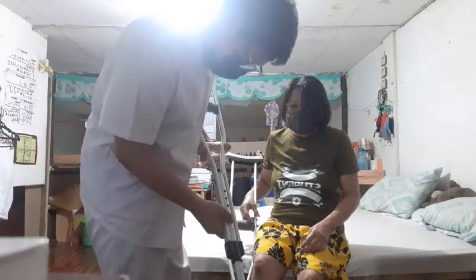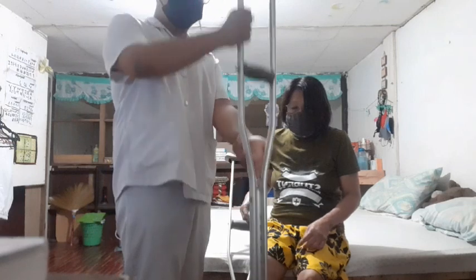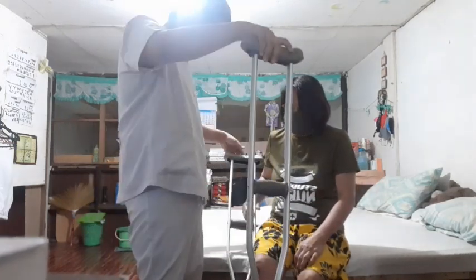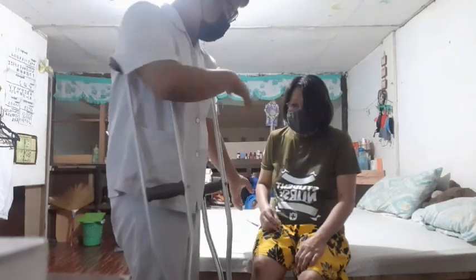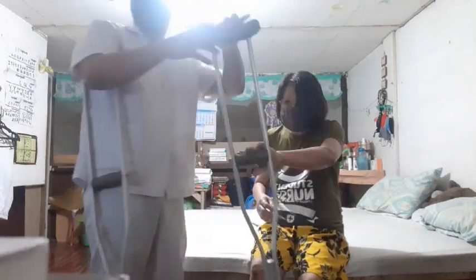Make sure the shoes are non-skid, hard-soled, and low-heeled. Assist the client with comfortable clothes. Measure the client for correct crutch fit. Make sure also to lower the height of the bed and lock the wheels, and then slowly help the client into a sitting position, and assist for any dizziness, faintness, or disorientation.